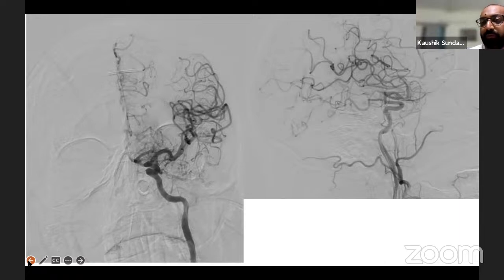That is an idea people take. Sometimes when we are not able to differentiate an acute and chronic occlusion, they assume that your carotid is occluded all the way from below. So they take the Neuron Max up slightly inside the ICA and then they start aspirating, and as they are aspirating, they push it up. It's not a bad idea, but when you are dealing with chronic occlusions, I don't know whether Neuron Max will easily track up. If it tracks, well and good, yes, I agree.